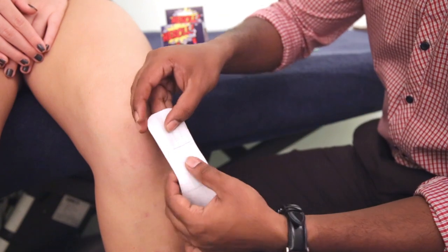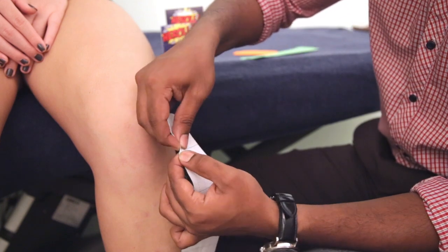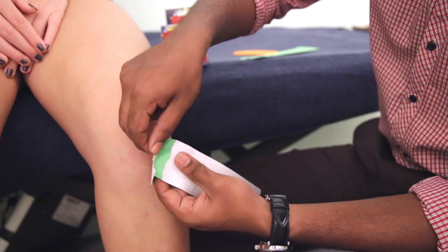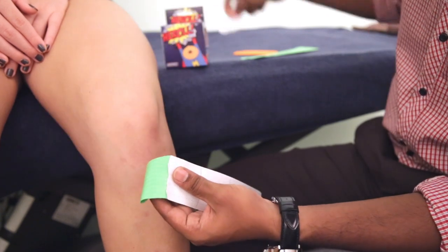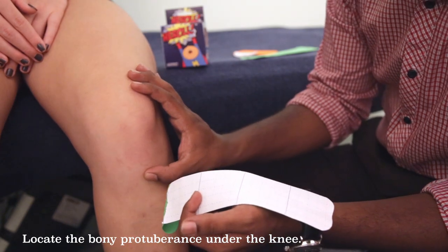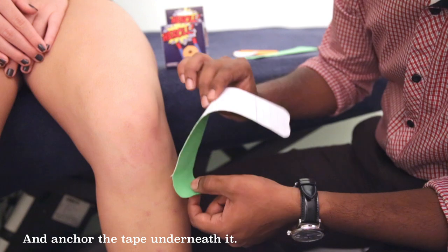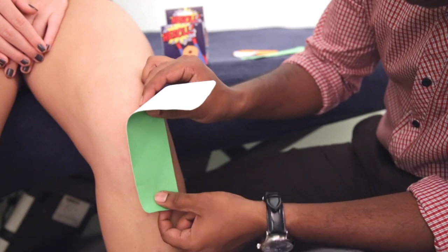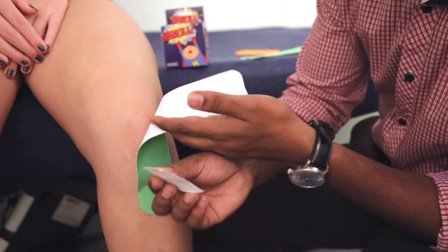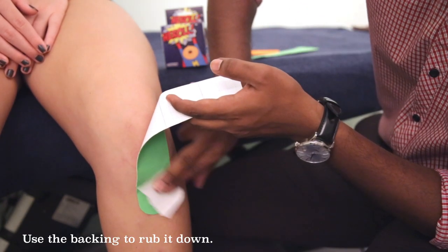So firstly, we will be tearing off the 25cm tape of the first box. Just remove the backing. You are going to be trying to find the bony prominence over here, and this part of the tape is going to go right under the bony prominence. We will be using the backing — just rub it down so it gives a little bit of heat to ensure it is adhesive.